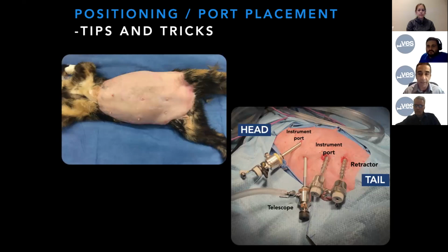And I will never forget that advice. We had a great human pediatric surgeon do our keynote at the VS in 2017. And he called them freebie ports, as Phil mentioned, and he uses them all the time in kids. I think that's some great advice, where the 2 and 3 millimeter ports, it's just a skin incision to close them. That being said, no hesitation placing a 5 or 6 millimeter port in.